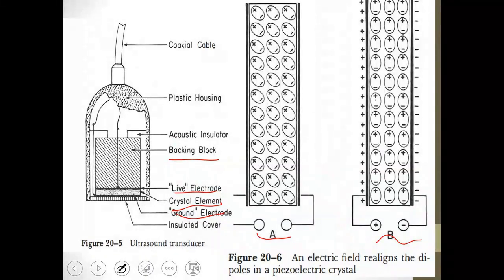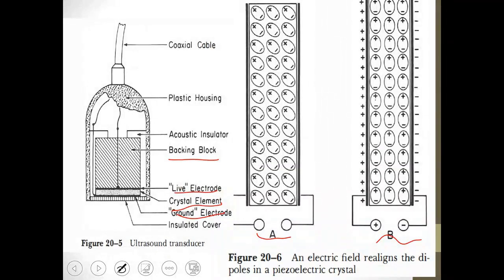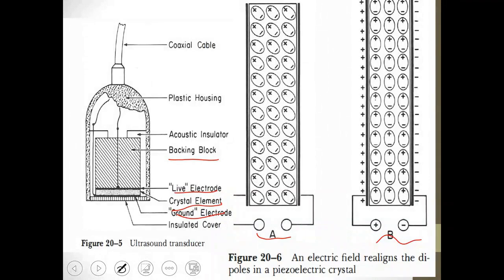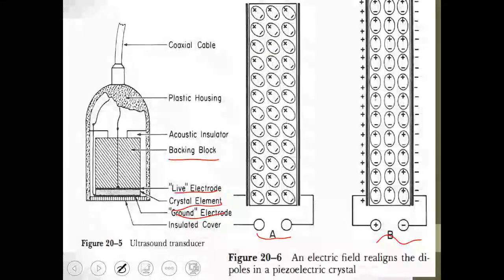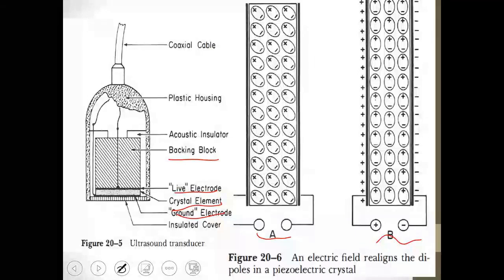Of course, inside the probe itself, when you open the probe, you will find that there is not just one crystal. The one I have contains over 500 crystals. As for the specification, for example, you have a probe that you use for Doppler and a probe that you use for the abdomen. There are also probes used for shallower or surface imaging, and others that you use for deep imaging, right?